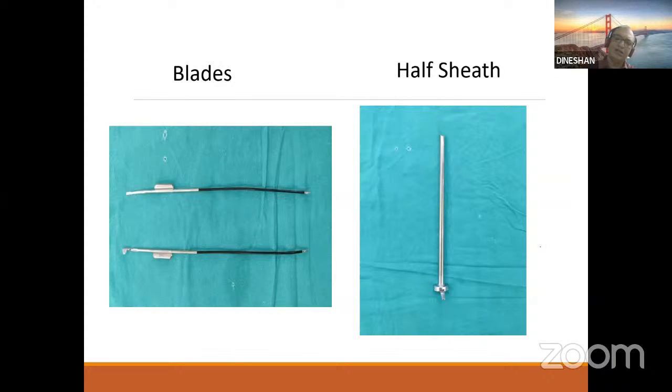And where to cut? See, always make sure that you cut at 12 o'clock, because that is the least vascular area, and the complication rates are very, very low. That is the least injury-prone area, because if you cut there, you don't have many vascular structures. And if you cut laterally, you may cut into the corporal bodies.